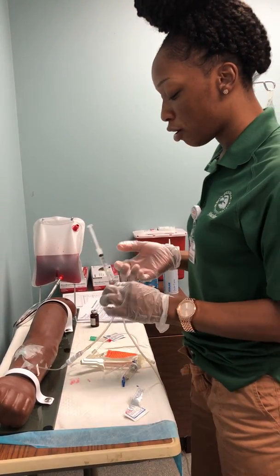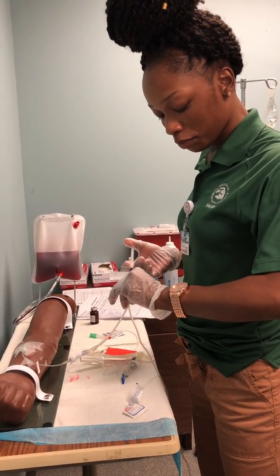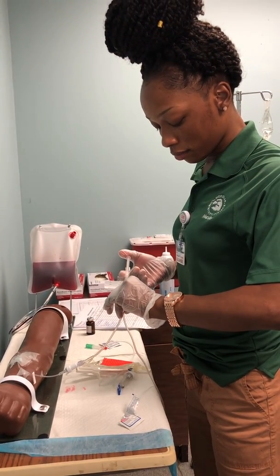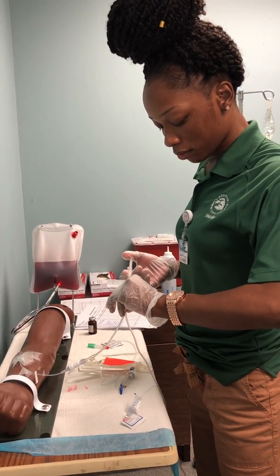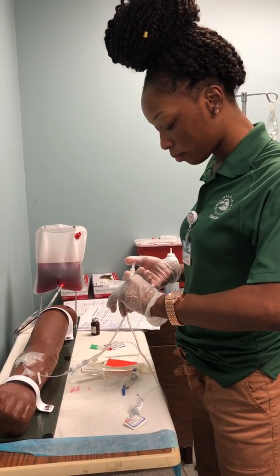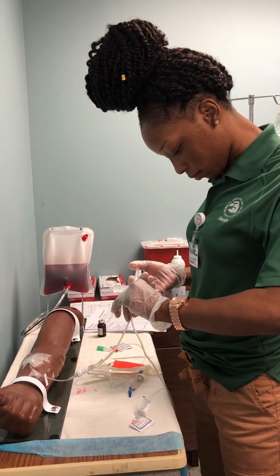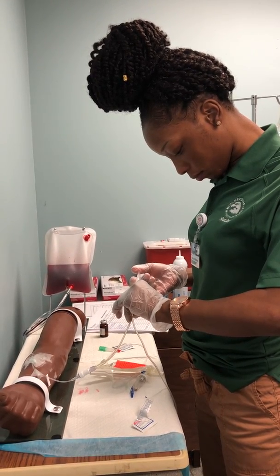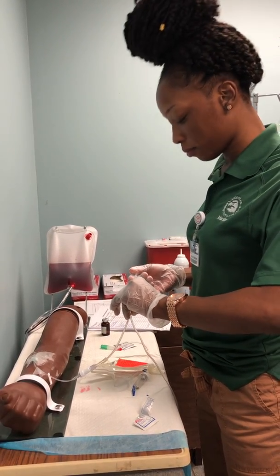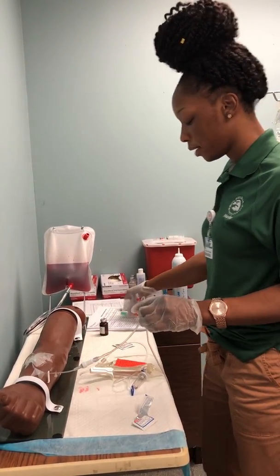And I will give the Lasix over 1 to 2 minutes. Push and pause. Okay.